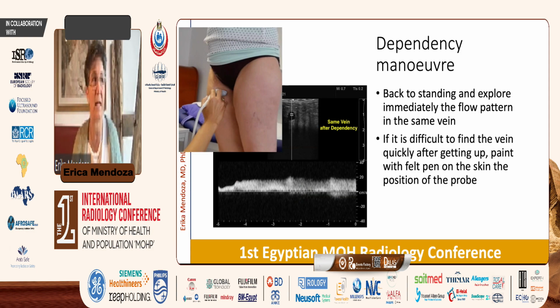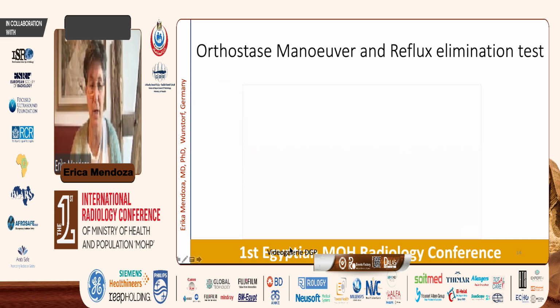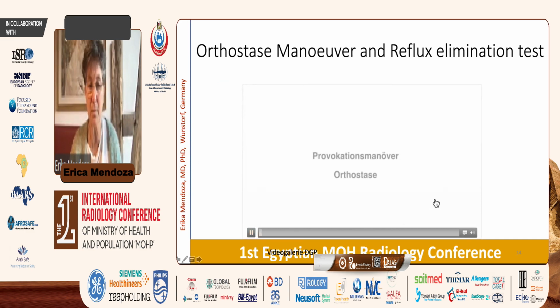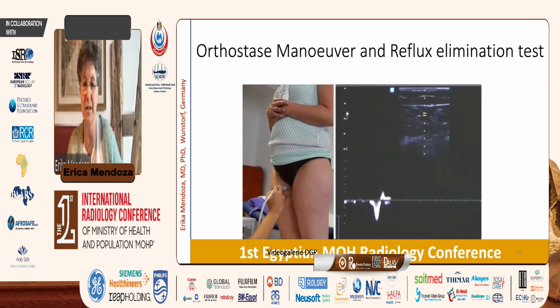I mean, I do it like twice a month, and I see very, very many patients, as you can imagine. But sometimes you have a discrepancy between what you expect and what you find. And then this is a really good idea to have a look. If you compare, this is after long standing, and this is after the dependency maneuver, and you obviously have a big difference. And this is why I brought it as a video to you, because this is really a very important take-home message.